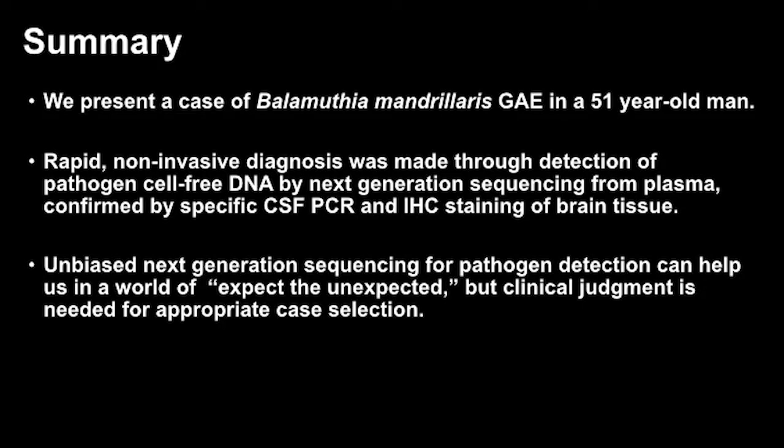And unbiased next-gen sequencing for pathogen detection really can help us deal with the kinds of problem cases that we see in our clinical practice.